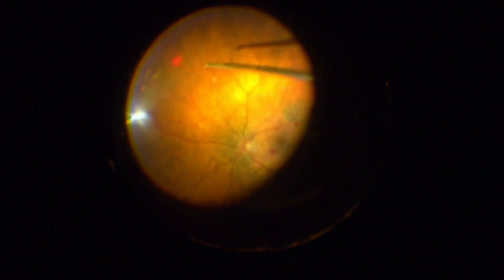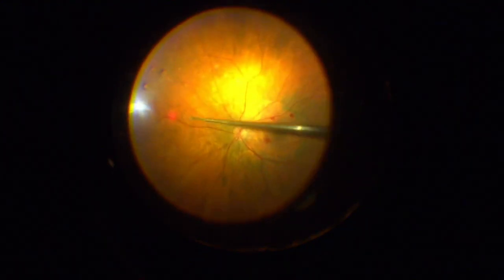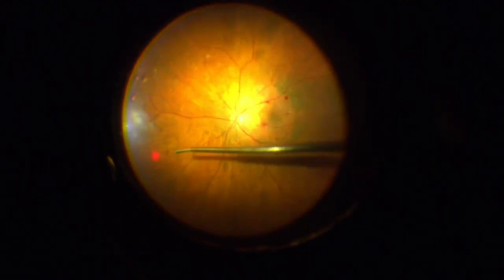So we don't need to put heavy burns in here. These can be fairly light gray burns. You know, that's my preference anyhow in PRP. I know in old days you'd see eyes that looked like a bomb went off inside. PRP was so heavy and intense.